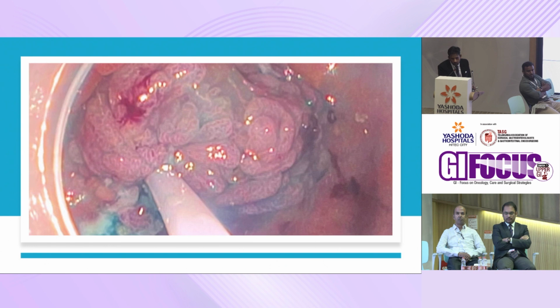People think they have removed the tumor, and then I see they use the APC to burn it, and recurrence is very high. So when the next slide goes on, you'll see why the EMR has got a high recurrence rate, just because somebody has attacked it, taken biopsies. It all heals by fibrosis. What happens is T1A becomes T1B because it's plastered to the below flooring. When you break something, you try to repair it, it just makes it difficult.